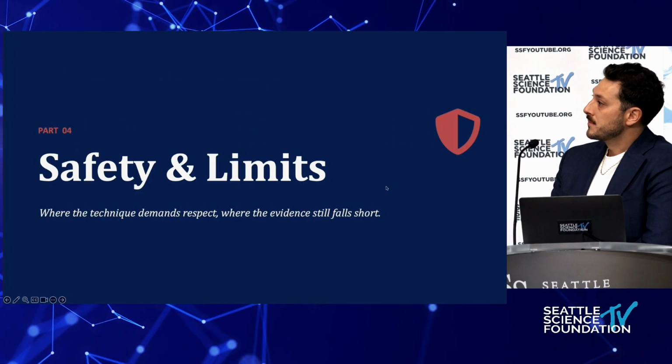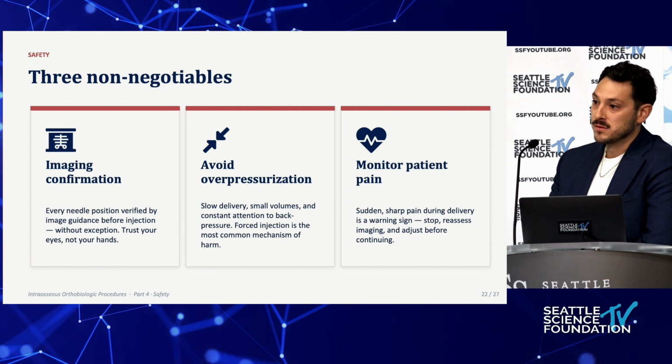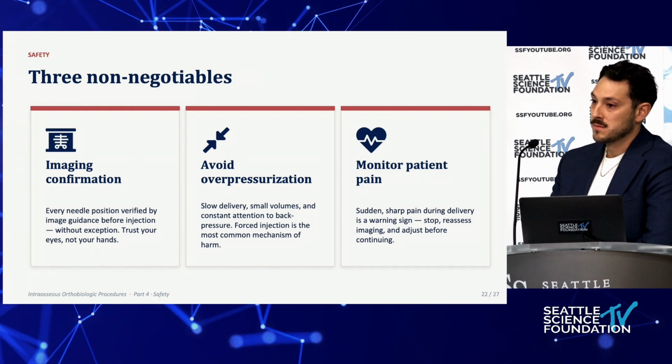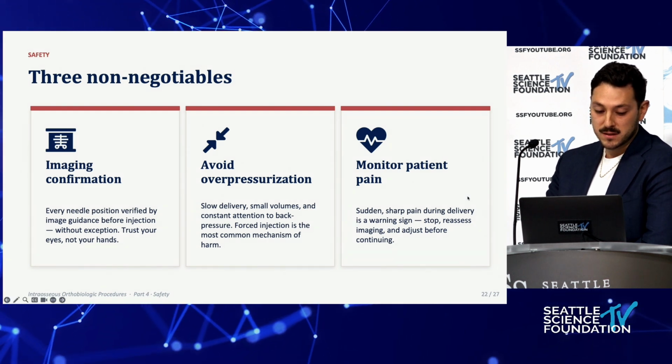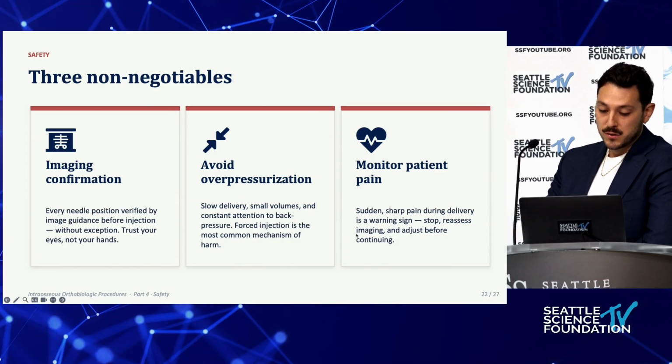We covered this here. So safety and limitations, this is all going to be image guided. You have to be using probably a combination of ultrasound and x-ray to make sure that you're not going to be going through something that you can't see. You want to avoid overpressurizing the bone. You use slow delivery, small volumes.